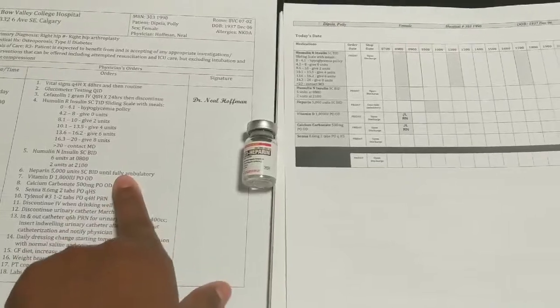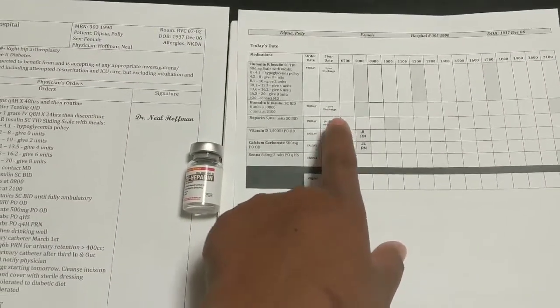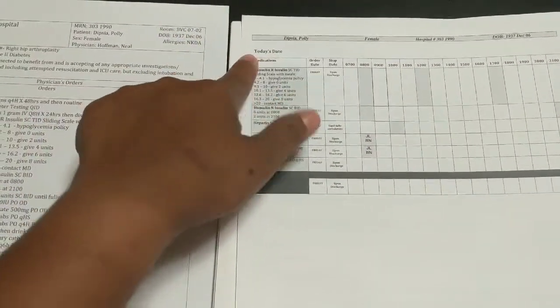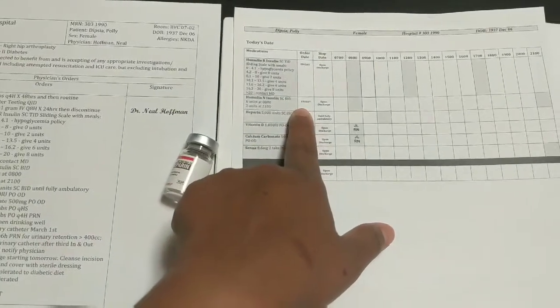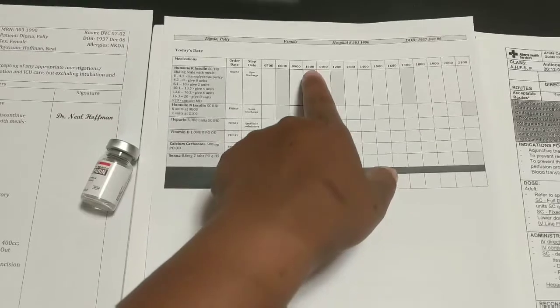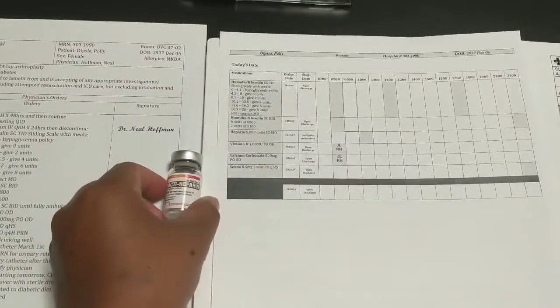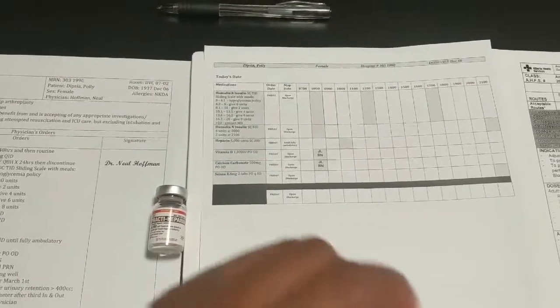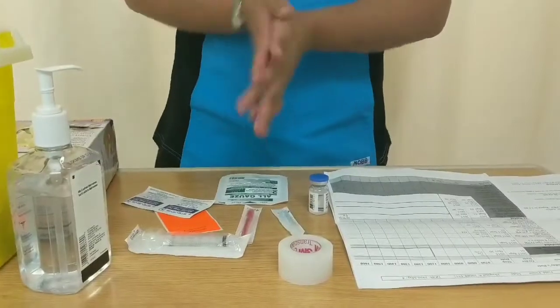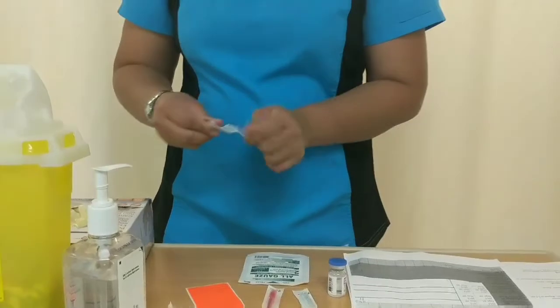until fully ambulatory. The order's date is Friday, which is today's date. So you'll see that the heparin is for the initial dose at 10 a.m., and that is the right time for the medication. Explain the medication purpose and document after. After the first check and ensuring the patient's 7 rights, you may now prepare the medication.